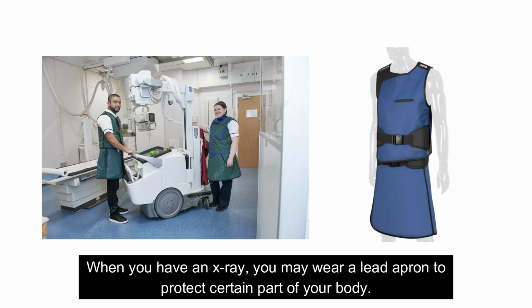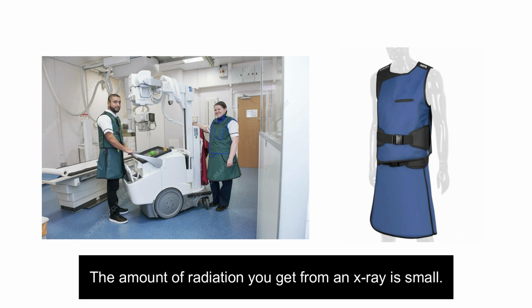When you have an X-ray, you may wear a lead apron to protect certain parts of your body. The amount of radiation you get from an X-ray is small.